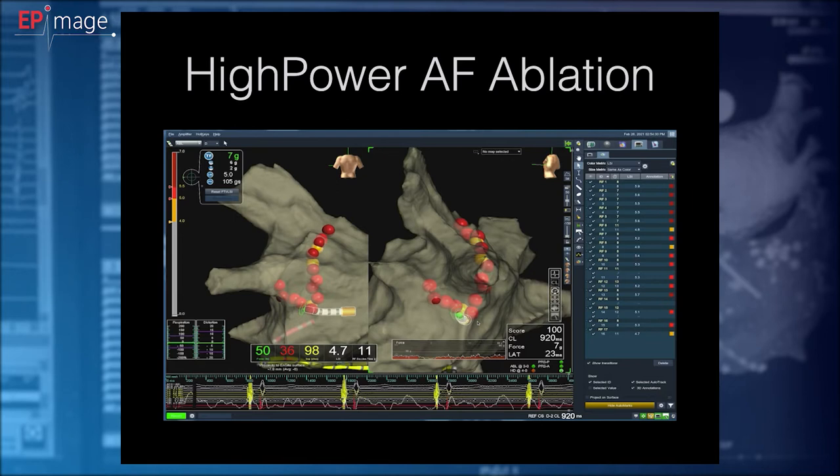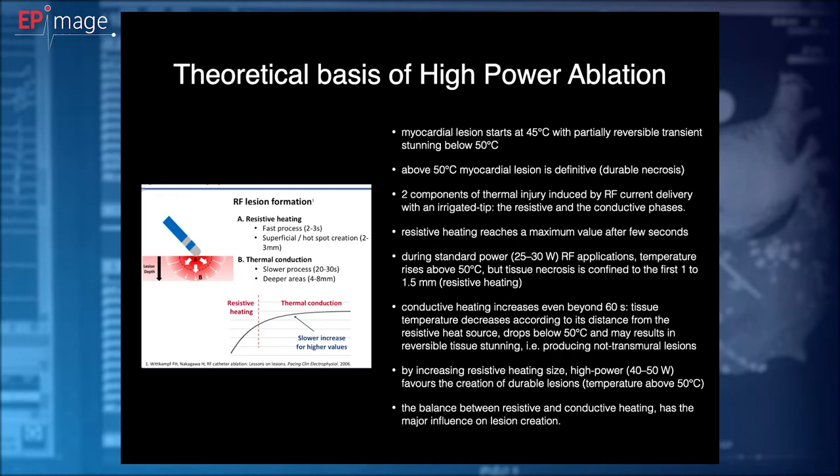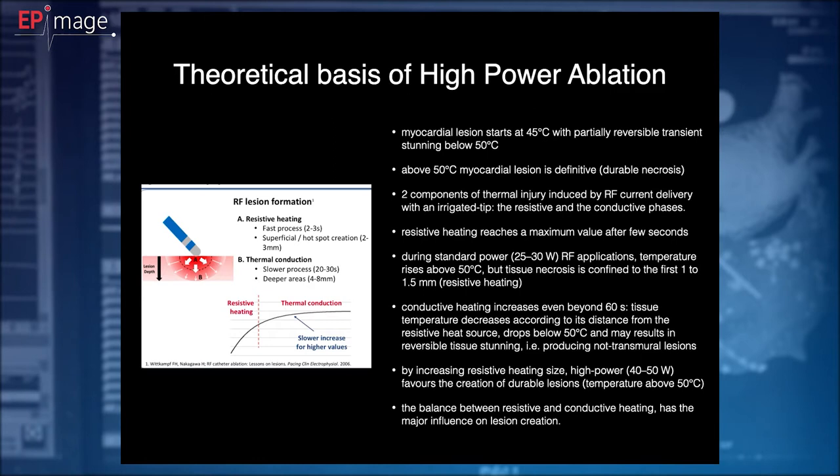So why high power ablation is better, in my opinion? When you think about formation of radio frequency lesion, you have two stages of creating the lesion. Resistive heating, which takes just a few seconds, and thermal conduction, which takes much, much longer. Myocardial lesion starts at 45 degrees centigrade with partially reversible transient stunning below 50 degrees centigrade. Above 50 degrees centigrade, myocardial lesion is definitive. We have durable necrosis.